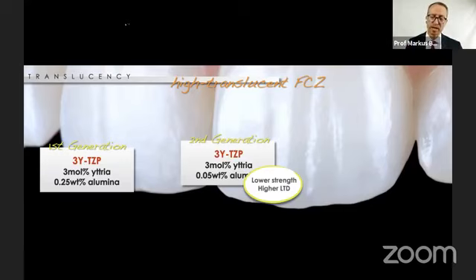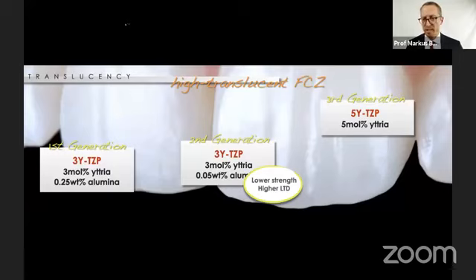So people said, let's keep the alumina the same, but change the particles by changing the yttria, which stabilizes those particles. That causes a higher percentage of cubic particles. We all talk about cubic zirconia, and cubic zirconia is a certain particle size and formation that is more translucent.